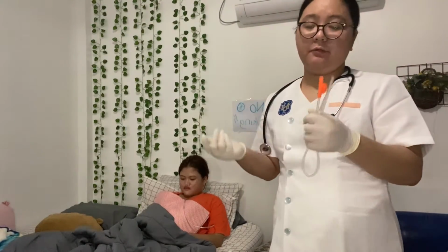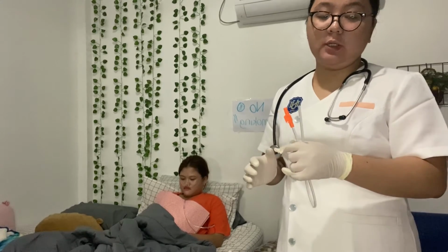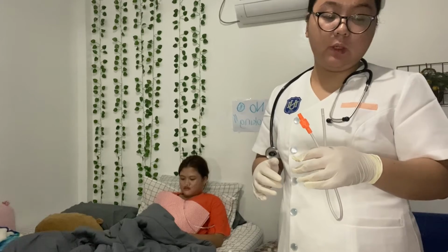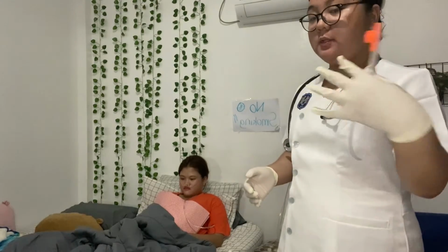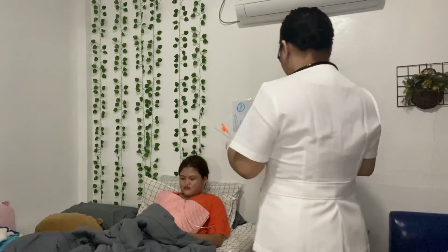Of course, after that, we're going to apply the sterile glove. And then pick up the suctioning catheter with the dominant hand without touching non-sterile surface. Pick up also the connecting tubing with non-dominant hand. So this is my dominant hand and this is my non-dominant hand.